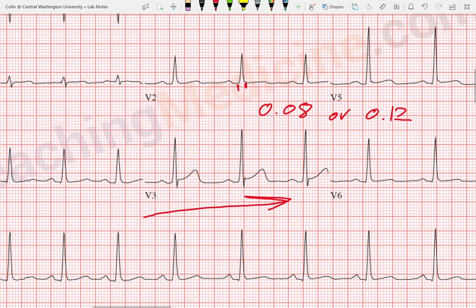So for example, if our QRS complex, instead of looking like this guy right here, looked like this, well, that's 5, 6, 7 boxes wide. And so now we know that things are taking longer to happen, which means that the electricity isn't following down the pathway that it has been on all the rest of them. All the rest of them, it's happening really quickly because it's following down the conduction system. Now it's not happening. And so what does it look like? Well, it looks exactly like this. Your QRS is wide because things are taking longer.